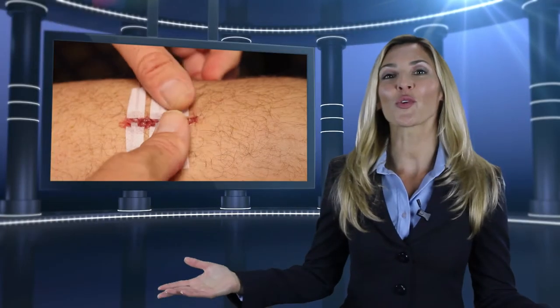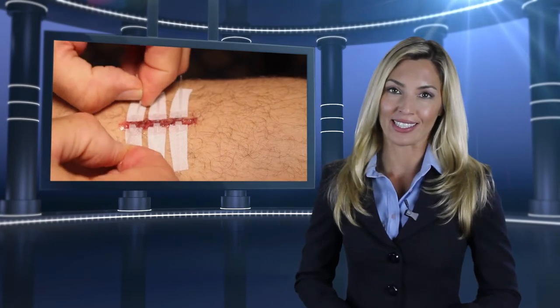This is truly a revolutionary product. Now you will achieve a true closure and great cosmetic outcome without the time and cost associated with hospital visits and sutures. Doctors love it and patients do as well. I recently had surgery and the doctor used Dermalock instead of staples or sutures. I didn't experience the itching and pulling during healing as I had in the past with other skin closure methods.